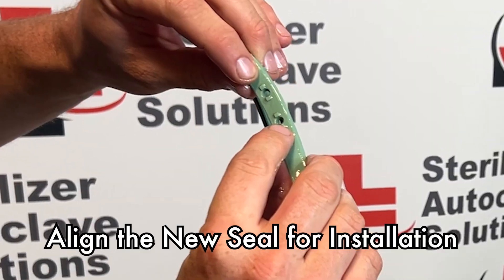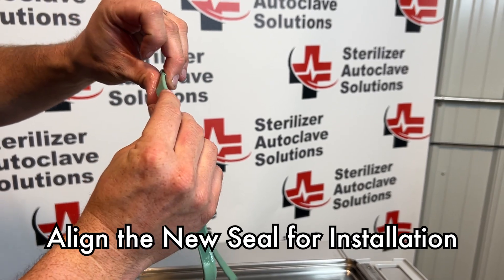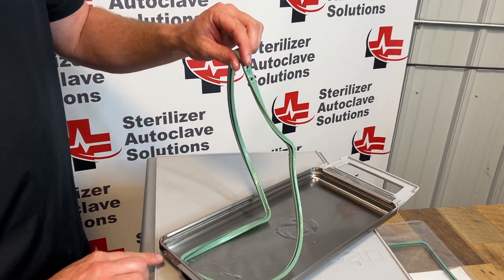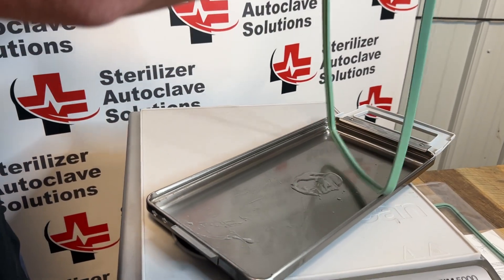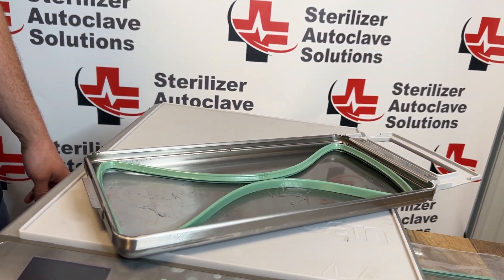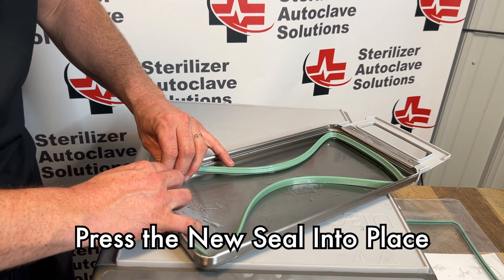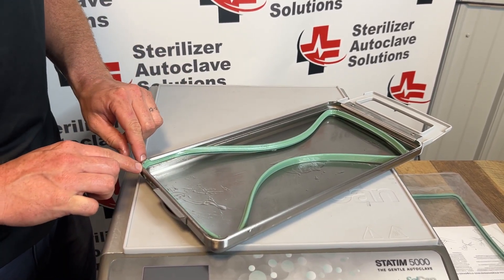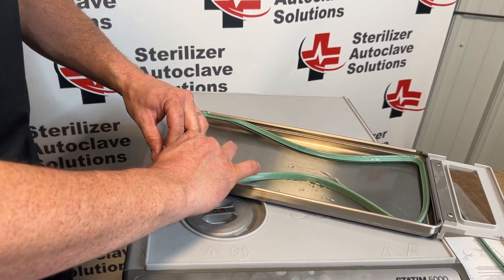We want to find the holes on the back and the nubs on the top. We're going to take those nubs, match them up with the back of our cassette, and gently place the seal in there. We're going to start in one of the corners by pressing in and up and try to line up the nubs in the corners. We're going to do that to all four corners.